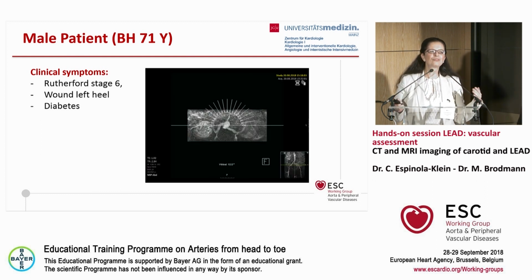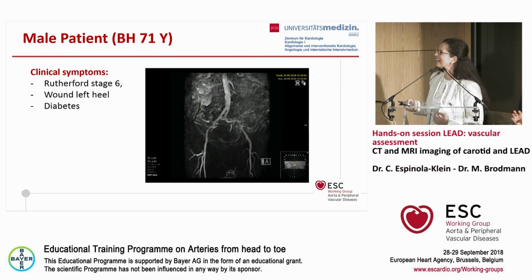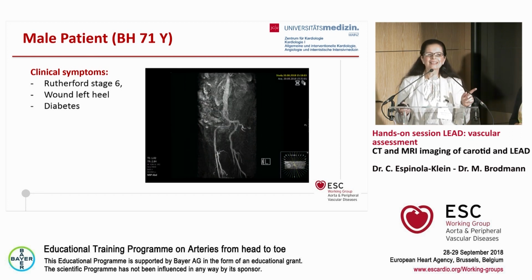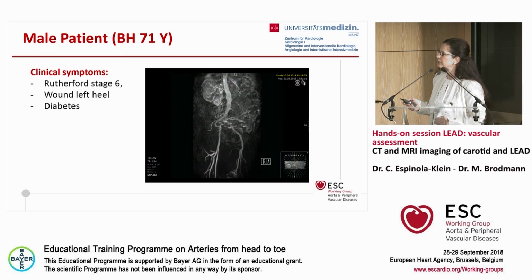It runs a little bit fast. I know we cannot stop it. The issue is we cannot stop it. This is the only way we Maybe we go to the next image, so you can see the problem a little bit clearer.